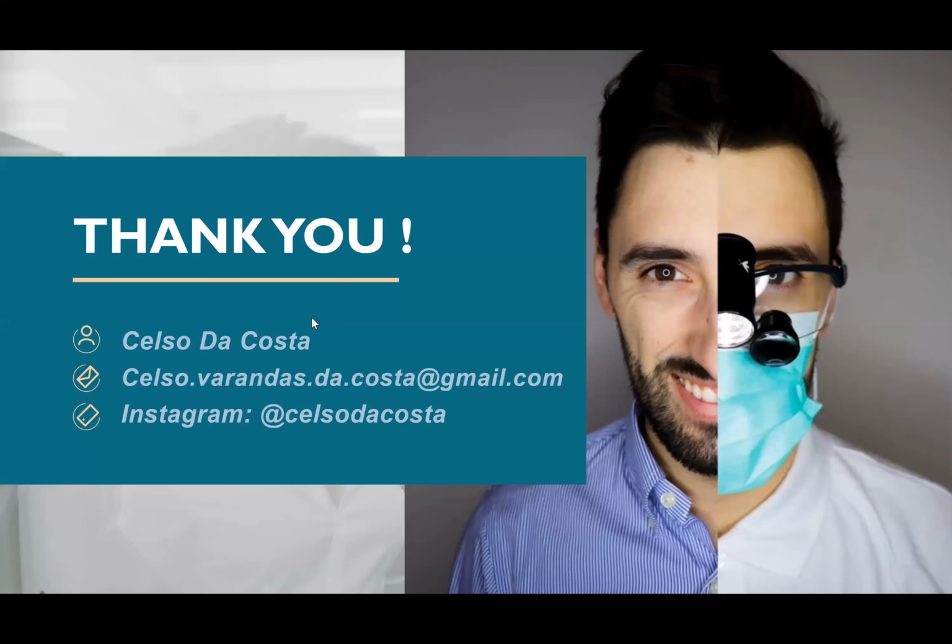The best thing is to do it right after the appointment, because it is the best way to get the best results. If you cannot do it, yeah, we can do it one day after, no problem, if you have some free time in your planning. Honestly, for me it's quite hard. Normally I take these patients after my schedule because I'm always full, but yeah, you can do it. But don't forget, do the airflow just to remove a little bit of the biofilm that already starts forming.